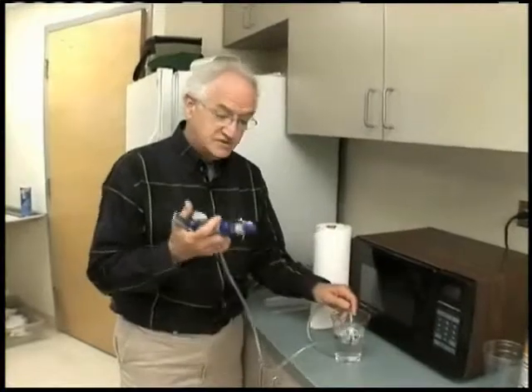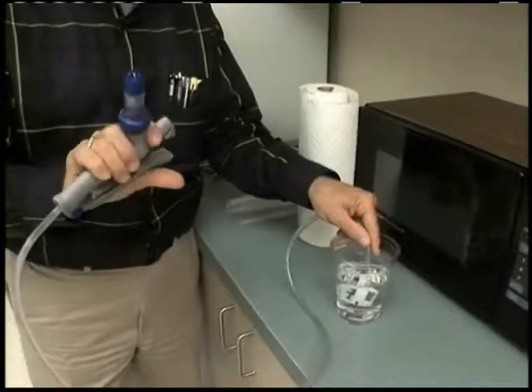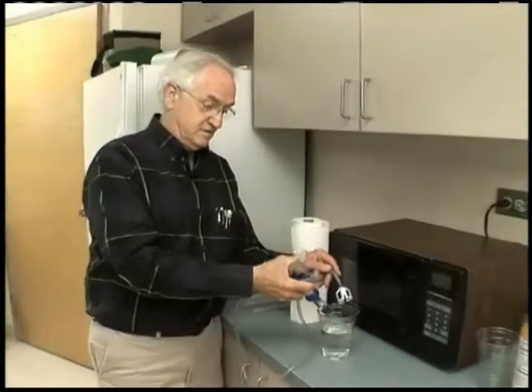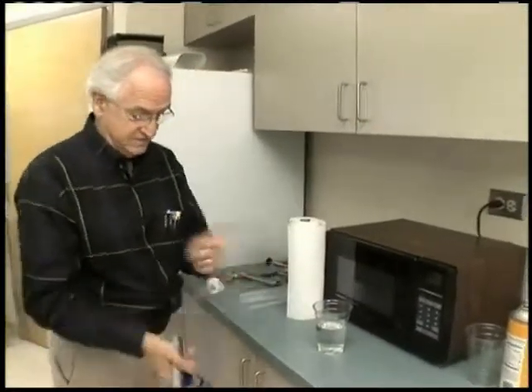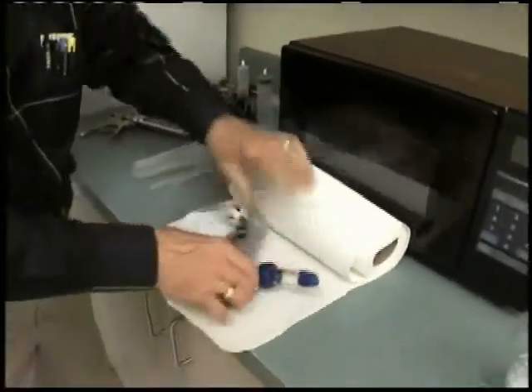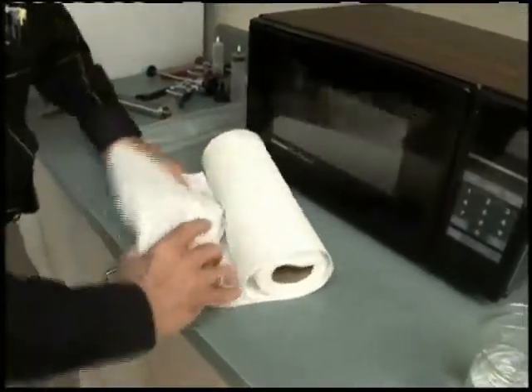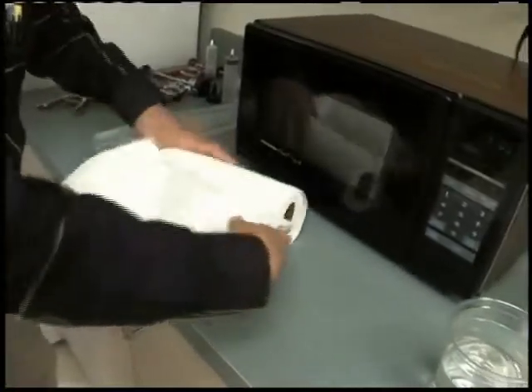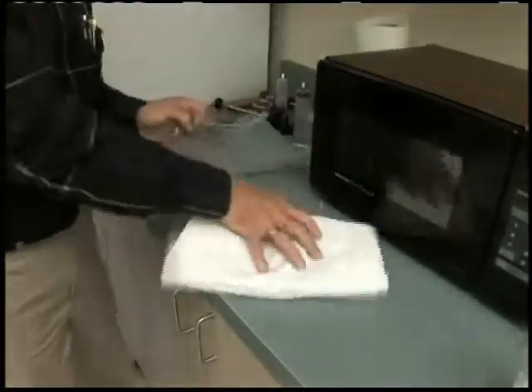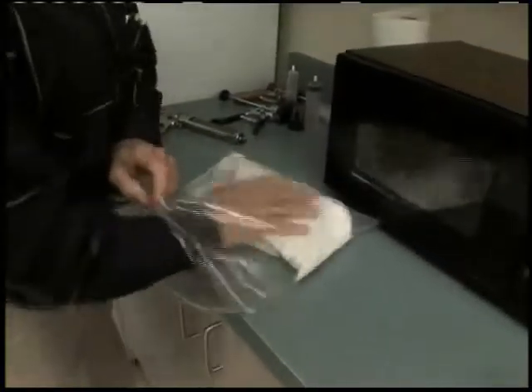I'm going to start by sucking some water up in this syringe. I don't need to have it completely full — I just need to get a little bit of water inside; I'd just as soon it not be completely full. Now I'm going to roll this syringe up and wrap it in paper towels. I want several layers. There is some metal in this syringe, but if you wrap it and get it really wet, there will be no sparking associated with that metal. I'm going to slide this syringe, wrapped in paper towels, into that ziplock bag.